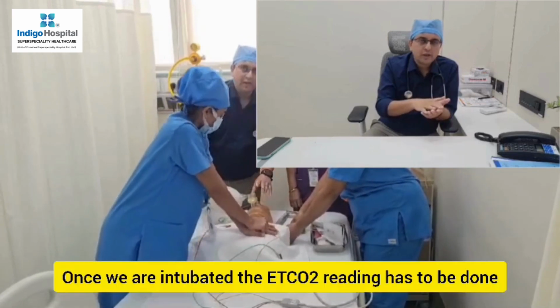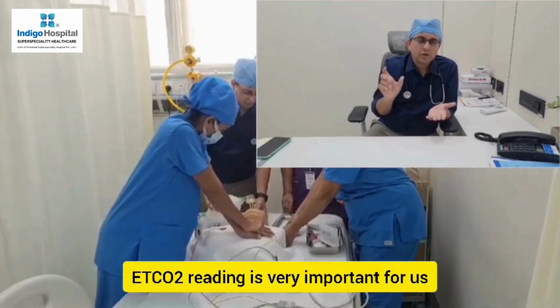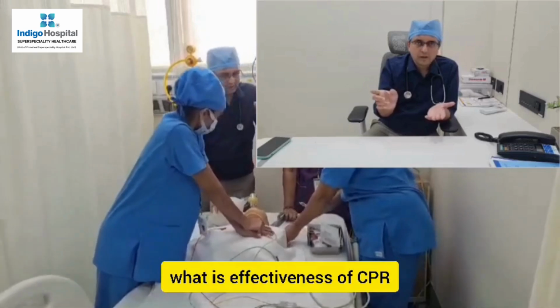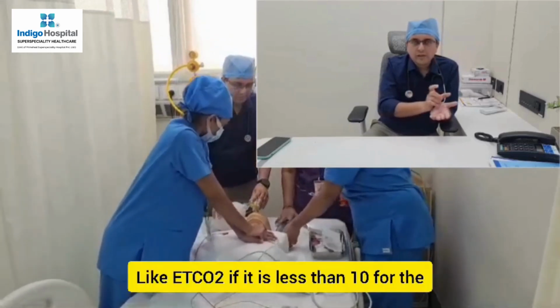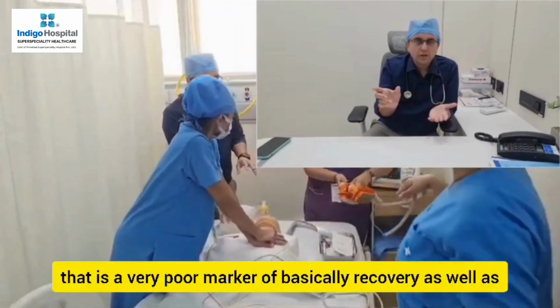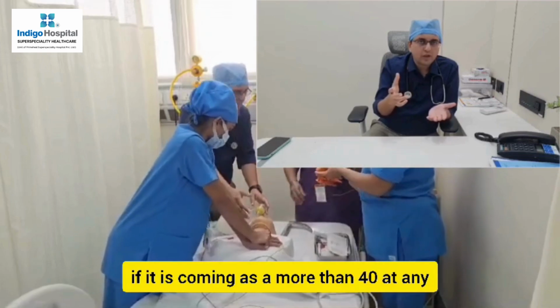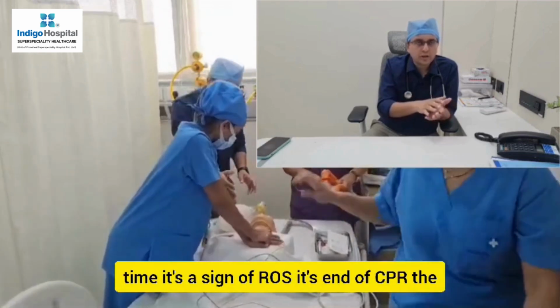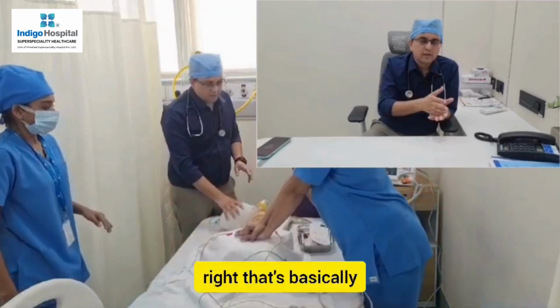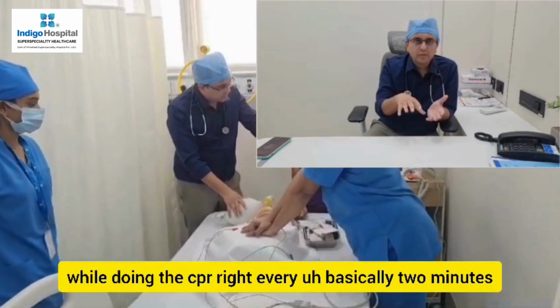Once we have intubated, the ETCO2 reading has to be done. The ETCO2 reading is very important because it tells us the effectiveness of CPR. If ETCO2 is less than 10 throughout the CPR, that is a very poor marker of recovery. If it comes as more than 40 at any time, it is a sign of ROSC, the end of CPR, meaning the patient has return of circulation, that is, basic circulation is achieved while doing the CPR.